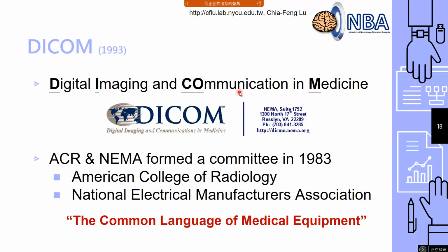So you can see nowadays in clinical practice, in medical environment, we always use digital imaging. Just like we use the cell phone to take a photo, it always stored in a digital way, right? So nowadays, I think it started from 1983, because the world is changing. Everything is changing to a digital format. So right there in this year, these two specific committee or association just created a new consensus or new format for medical imaging. It is so-called digital imaging and communication.